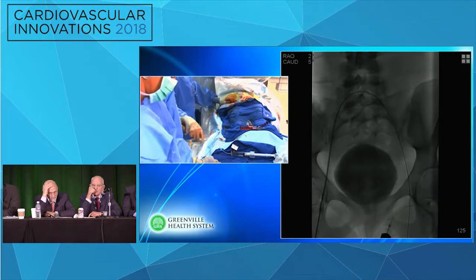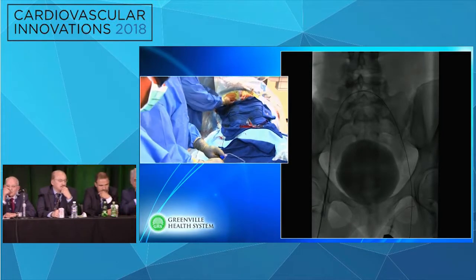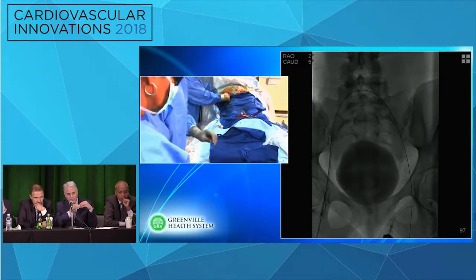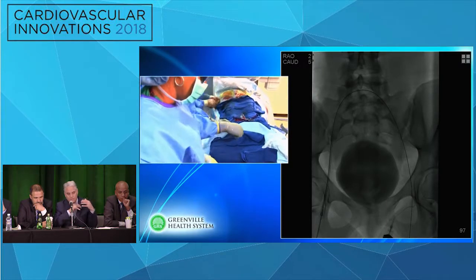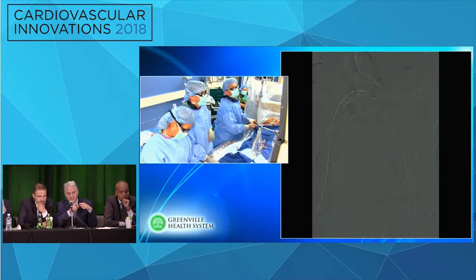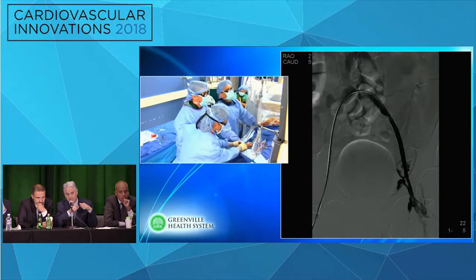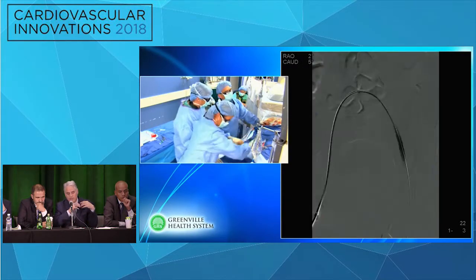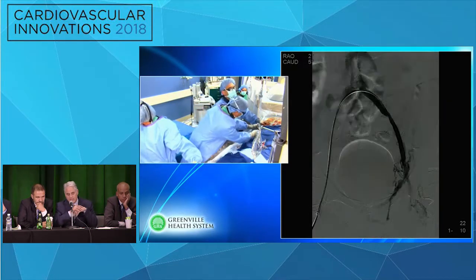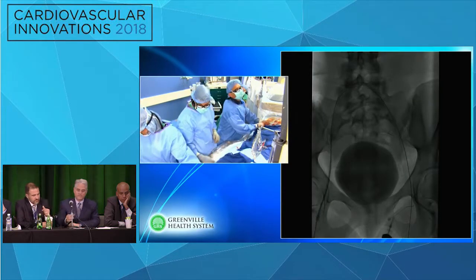Kenny and Mike's points are very well taken, though, and that is, with the wall stent, which unfortunately is the only stent that we have, we don't have any dedicated venous stents available in the U.S. And you have to progressively dilate that, because if you take a really big wall stent and you haven't adequately dilated or prepared that segment, you might be very surprised where your stent lands up. You're going to have potentially a lot of elongation of that stent. So it's really important to just progressively and painstakingly take the time to dilate in a stepwise fashion so that you're fairly close to what you think your final diameter is before you actually deploy the stent. Yeah, you got it? Okay.